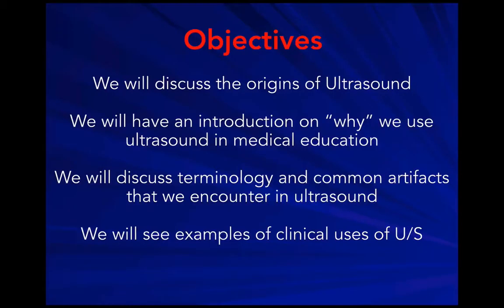The objectives for this introduction are to discuss the origins of ultrasound, why we actually have ultrasound in medical education, discuss some terminology and some common artifacts that we encounter in ultrasound, and we'll go through an example of clinical use.